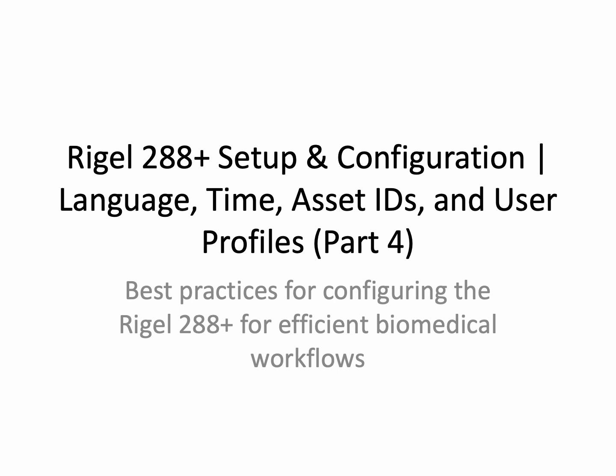In this session, we'll focus on the configuration settings of the device and how they shape how the Rigel operates day to day. So while testing procedures ensure accuracy, setup and configuration ensure consistency. We look at language and time settings, also asset ID organization, user profiles, and database management. When these are configured properly, these features help maintain traceable, error-free testing and make audits a lot easier.